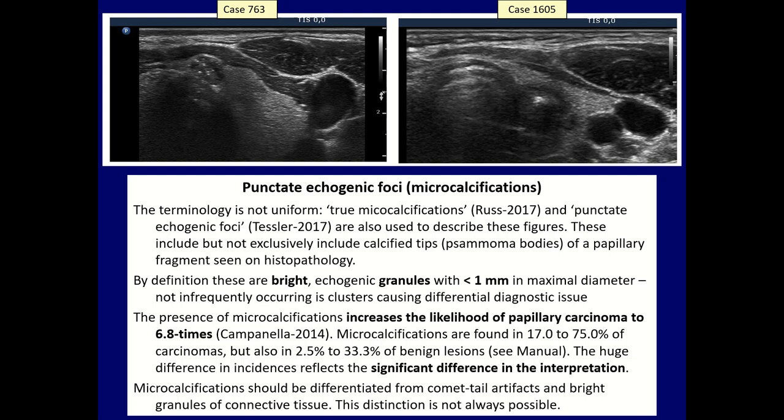The terminology is not uniform. In the European TIRADS, the term 'true microcalcification' is used and is restricted to clear, unequivocal forms of microcalcifications. The ACR TIRADS introduced a new term — 'punctate echogenic foci' — which is more appropriate to describe hyperechoic granules, because we cannot exclude the possibility that behind a bright hyperechoic granule, not a microcalcification exists, but other structures.